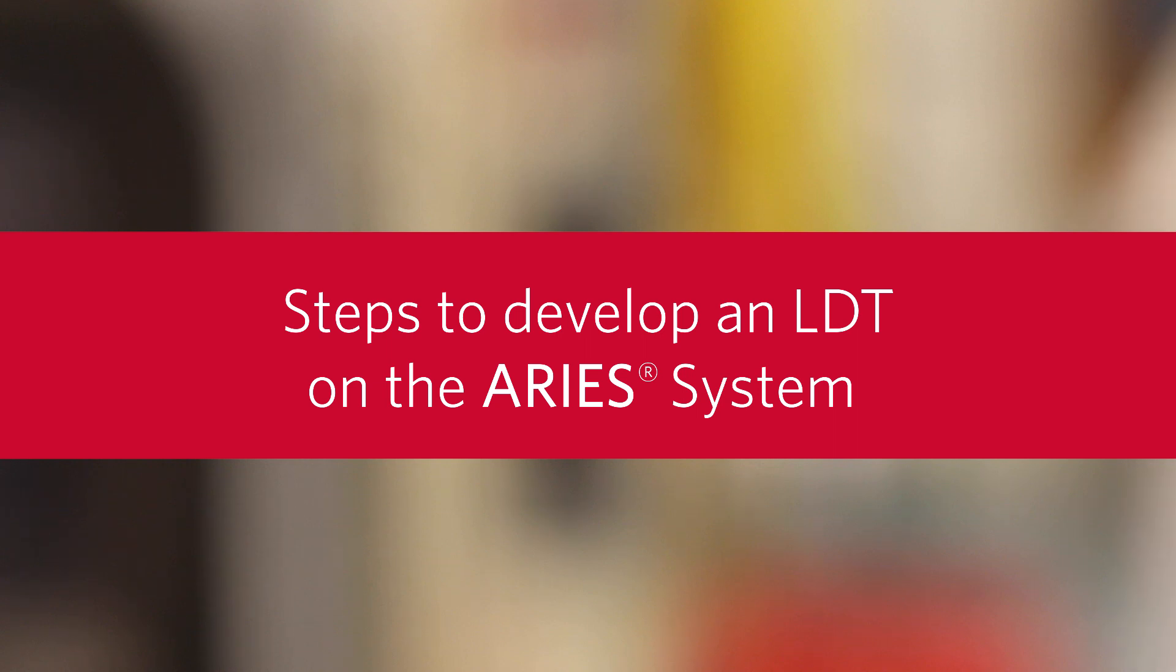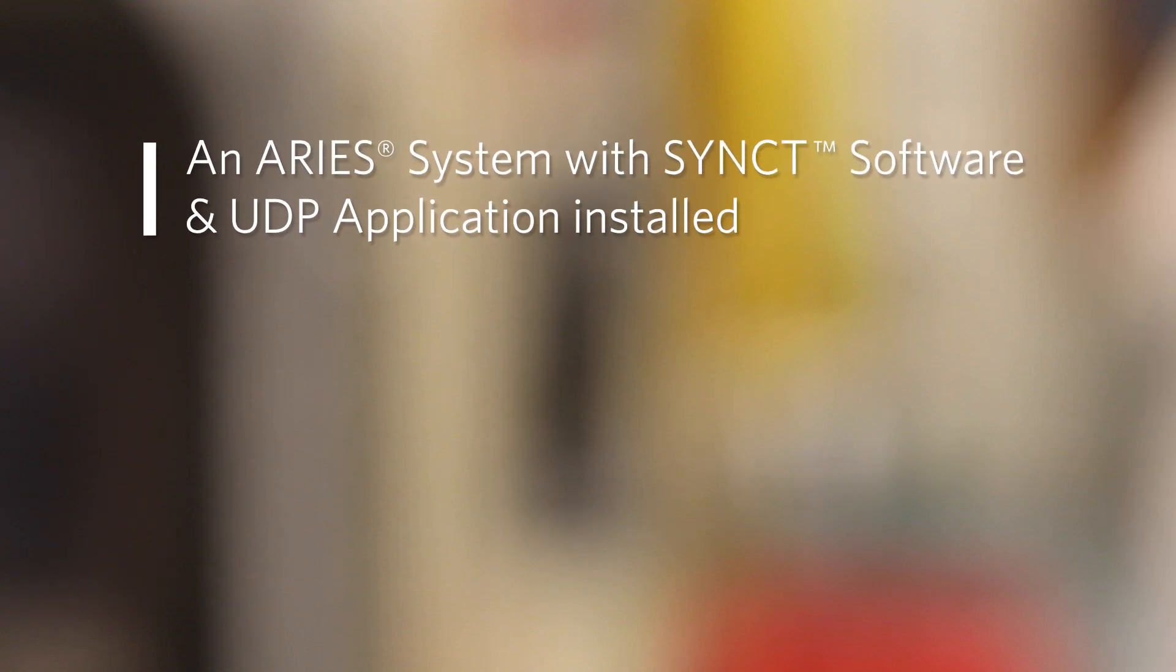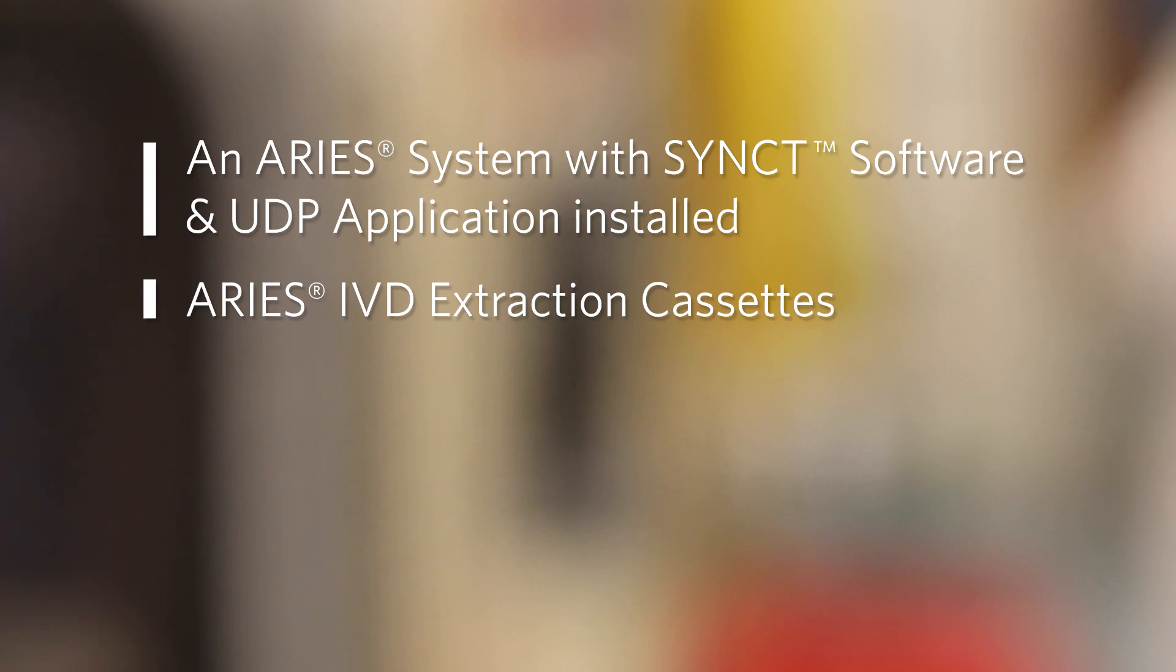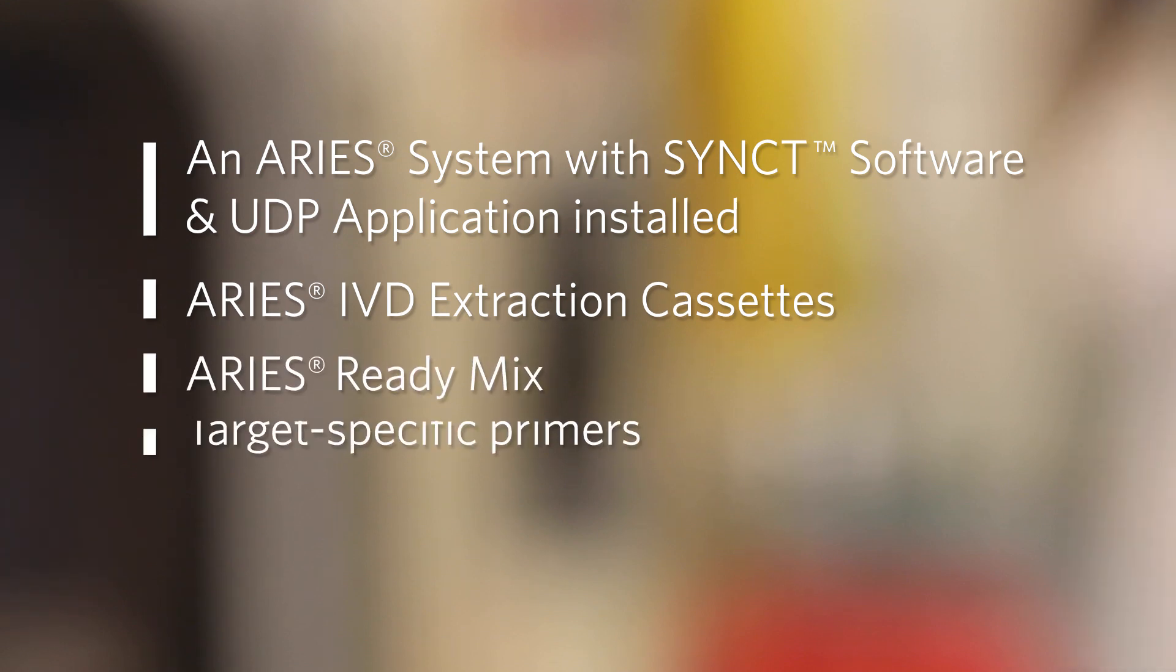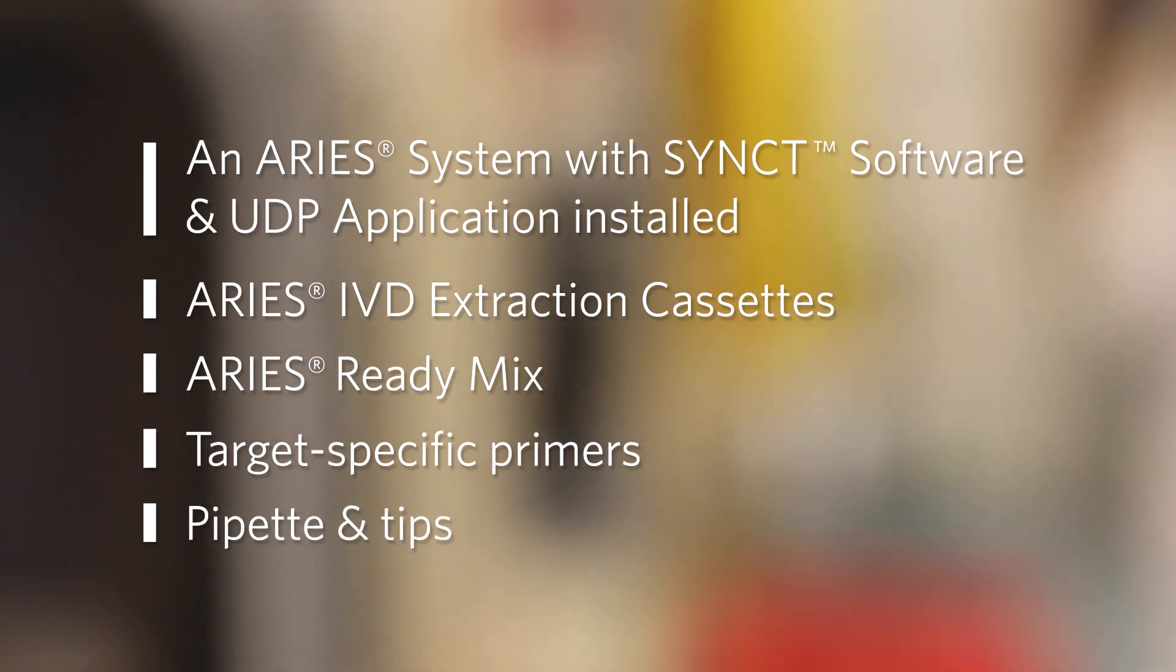For this example we will use an Ares system with synced software and the UDP application installed, Ares IVD extraction cassettes, Ares ready mix, target specific primers, a pipette, and tips.